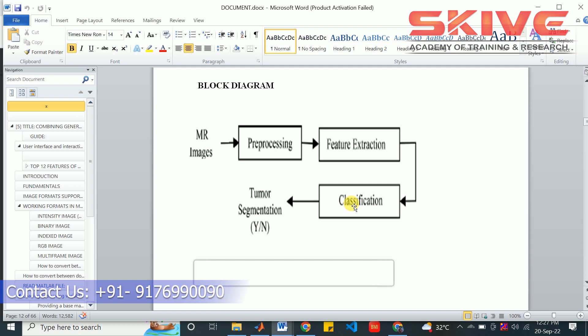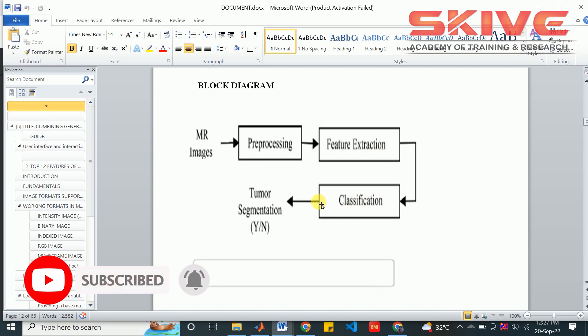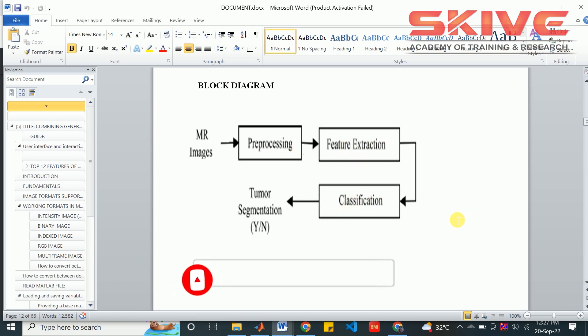So we can easily classify the given input image by using the model. We can test it by providing the image with all these pre-processing steps to the model. Then the model will classify whether the patient is affected by cancer or not. After that, tumor segmentation will be applied for the affected patient's image.